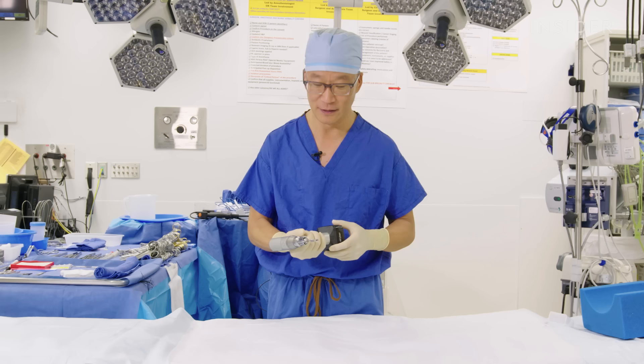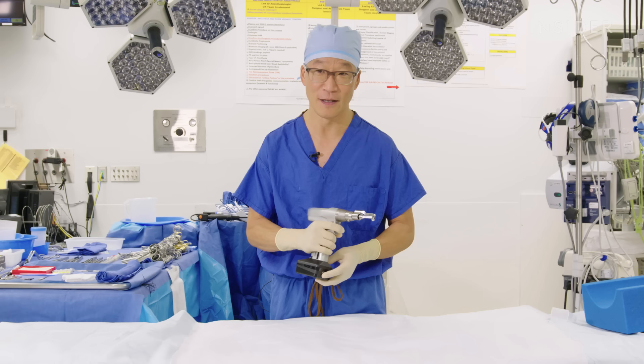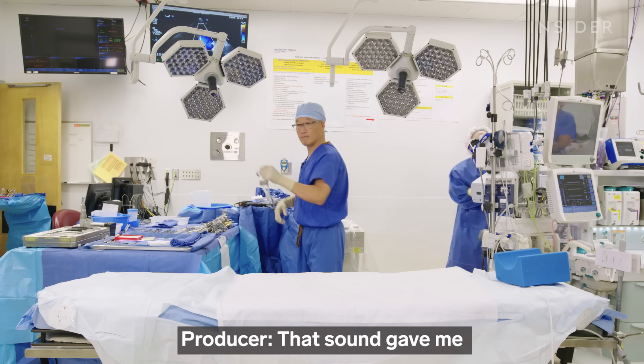It has a safety mechanism, obviously, because it can be very dangerous, and we unclick the safety mechanism, and like any other oscillating saw, it has a throttle which allows us to give very high power or very low power, and this is how we get through the breastbone.